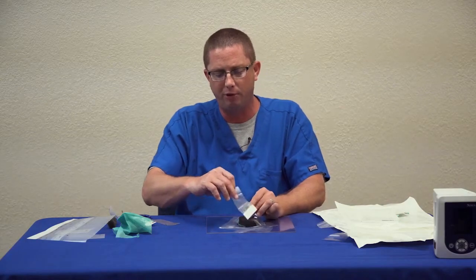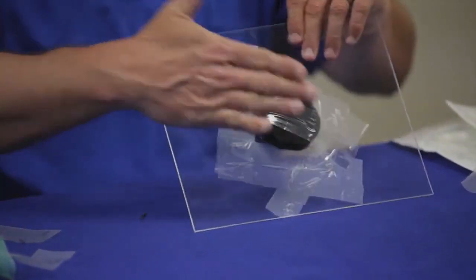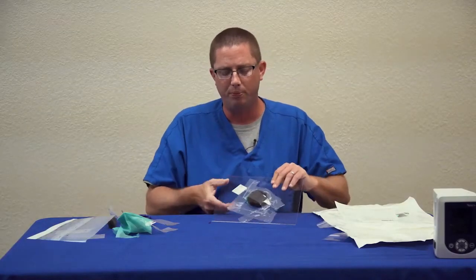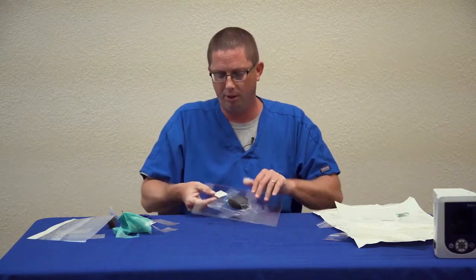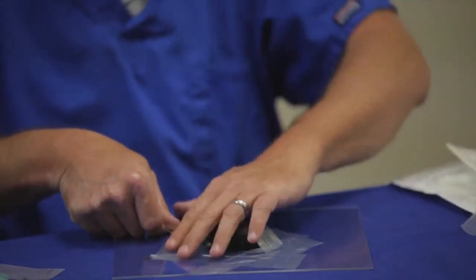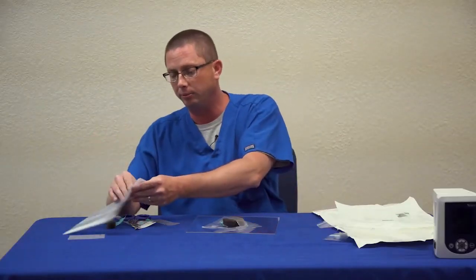So then I'm going to cover this, keeping this all intact. Apply my foam. When applying the drape over the top, do not compress the foam. The negative pressure device will compress the foam. All that can cause is pain and discomfort to the patient. So from there, I'll remove number 3 again. Pull the tab. Then from here, I can continue covering the entire wound base.